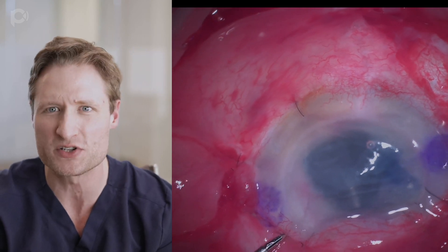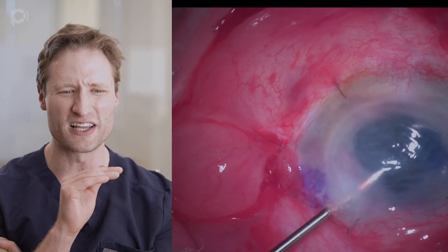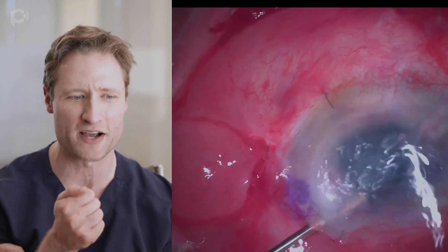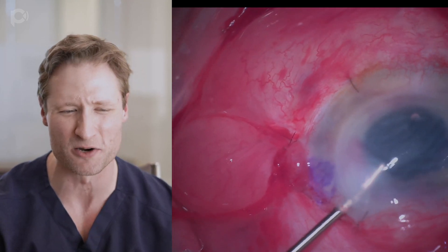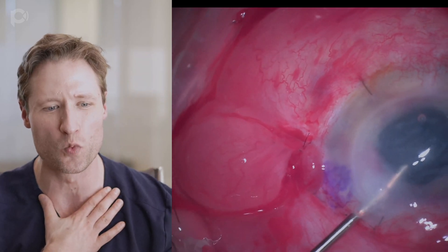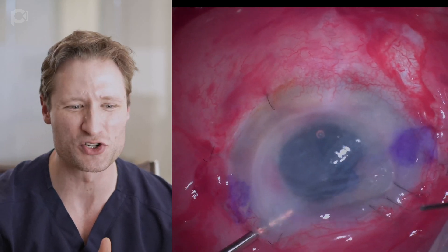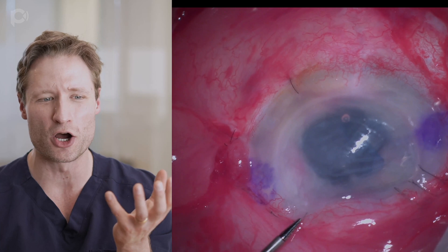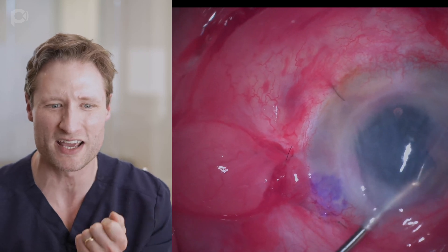The graft is a little bit inferiorly decentered, so I'm going to try to grab the edge with these coaxial forceps and pull it up towards me. I'm having trouble engaging the tissue, however, because of a problem I created with the wound. I made the main wound when the eye was soft, so the wound is long — way longer than it should be. I'm trying to grab the graft and drag it over, but the wound is so long I'm bumping into its edge and having difficulty pulling the graft towards me.